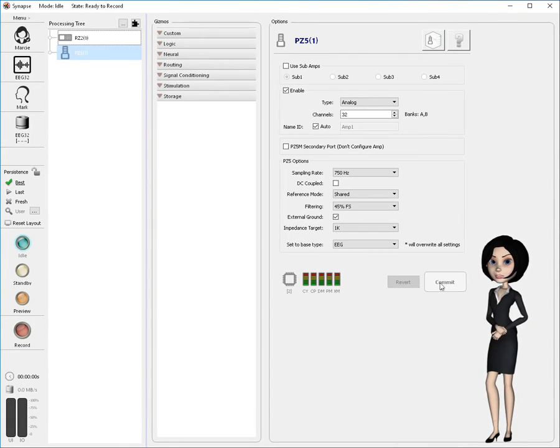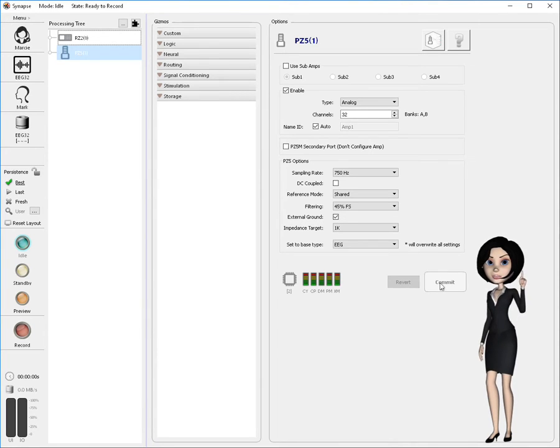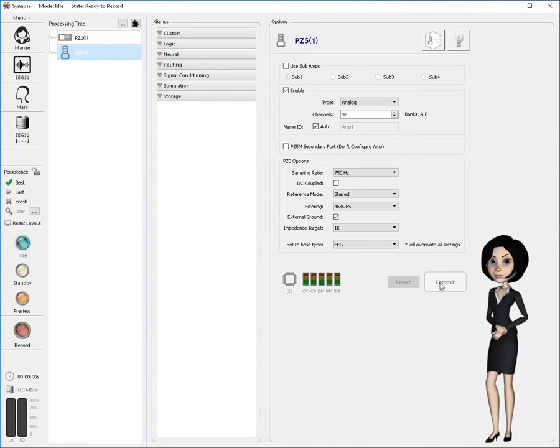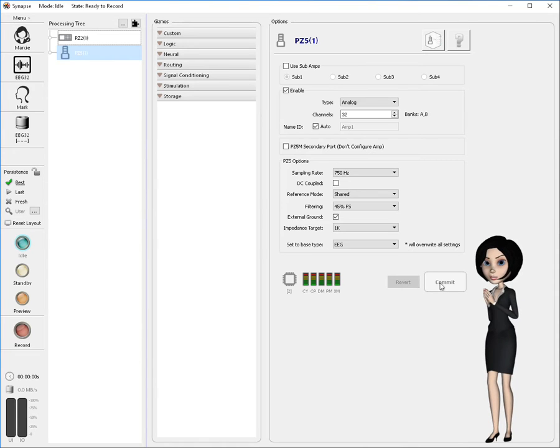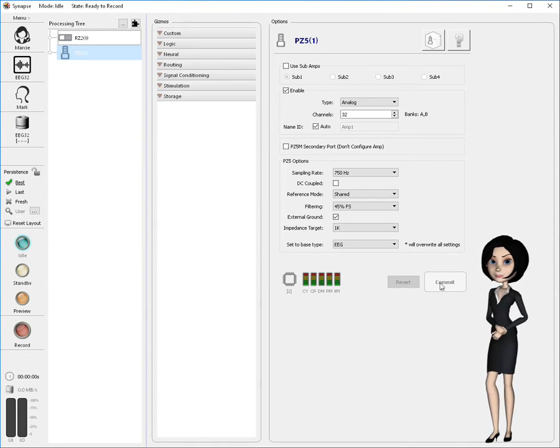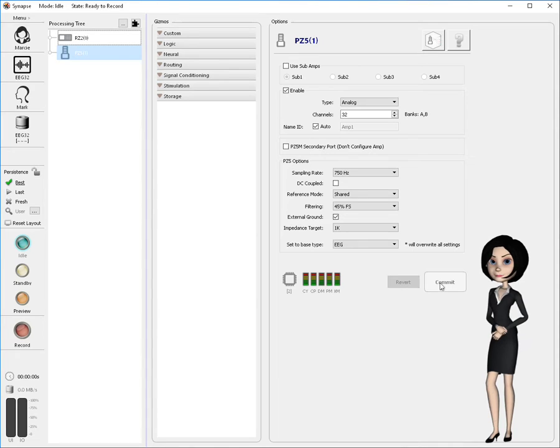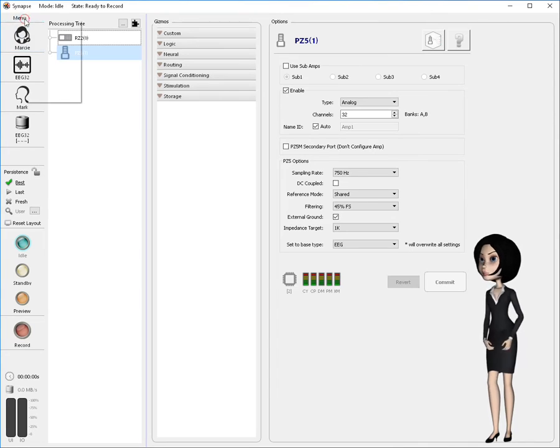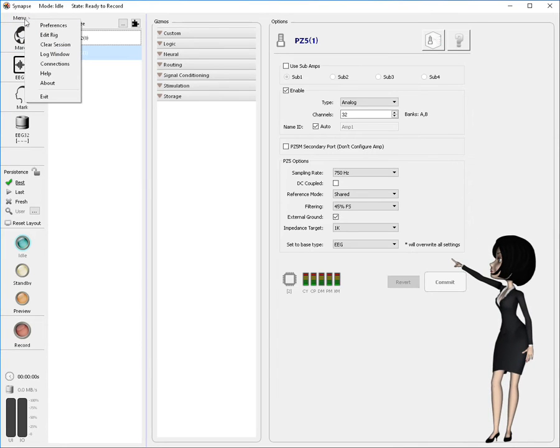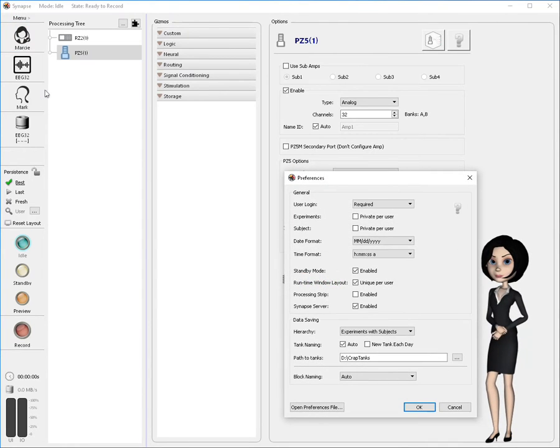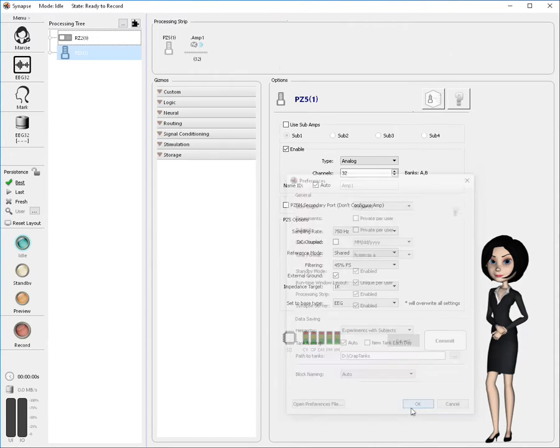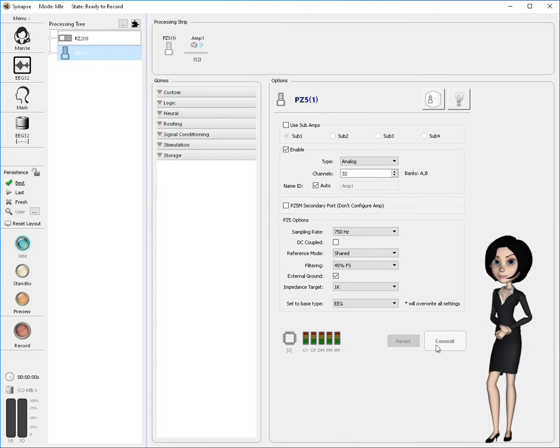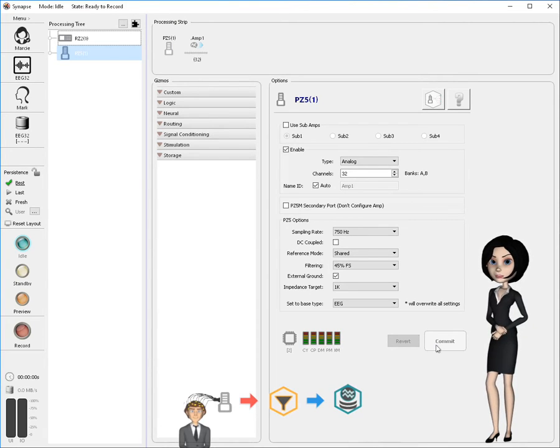This demonstration is about understanding signal flow and gizmo connections. I'm going to show you all the ways Synapse helps you visualize this flow in your experimental designs. One way is by enabling a panel called the processing strip. This strip offers a linear look at the primary signal flow upstream from the selected gizmo. I'll enable it now via the preferences dialog and demonstrate its use a bit later. With the processing strip visible, let's continue building our experiment.